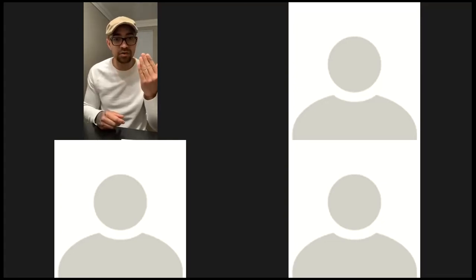It's going to be mottled and noisy. So that would have a lower contrast resolution with the inappropriate technique. But if I take that thinner slice and I raise my dose to the patient, I use more mAs, essentially, now I've compensated. Now my thin slice can have good low contrast resolution as well.